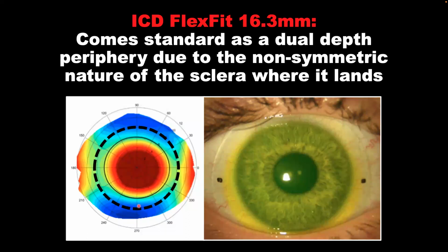They were saying, oh, so you see, having toricity fitted on every patient is not necessary. Nowadays they have made more studies, and that is why, as you may see now, every fitting set has toricity, just because the studies really display that going farther from the limbus, your sclera is more toric.